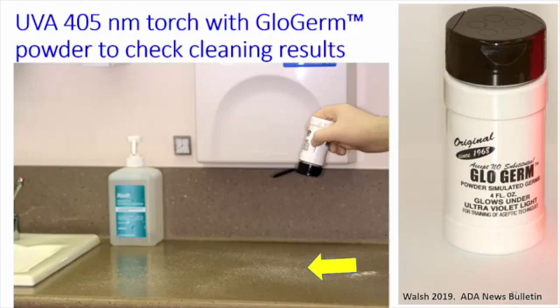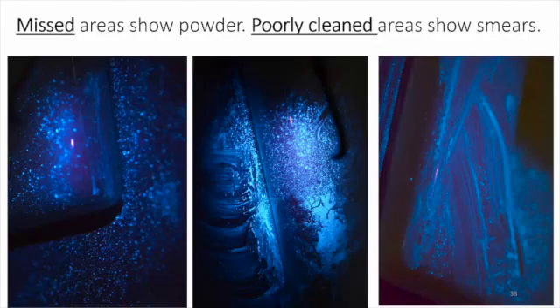And if you have a dark benchtop, you can put in just a very small amount, which still won't be able to be seen. But you can see it with a very simple fluorescent tube or LED that is working in the visible violet range. So you come back and you have a look. Here we are just on the side of a hand washing basin. We can see the basin on the left of each image and also this adjacent benchtop. So if the staff have completely missed the area, then you can just see the powder. If they've done one part but not the other, you can see some drag marks where they've been over the surface just once, and of course some powder where they haven't been at all.